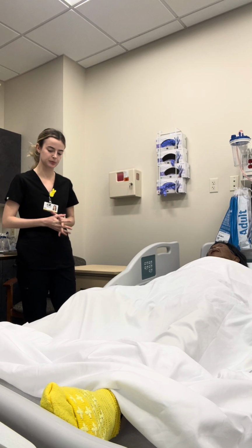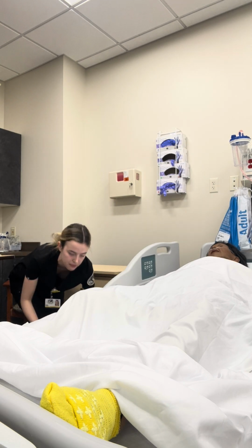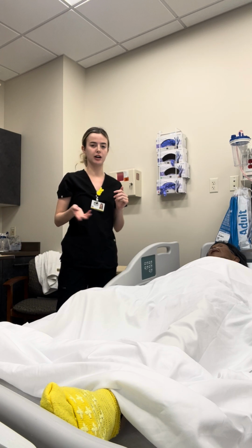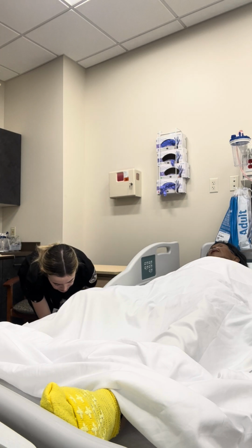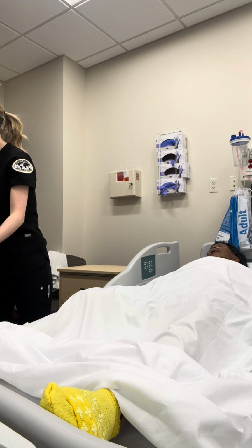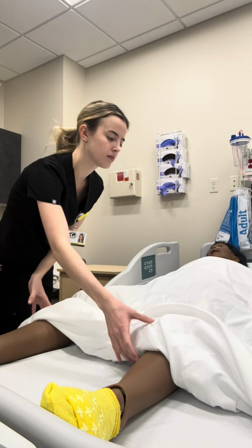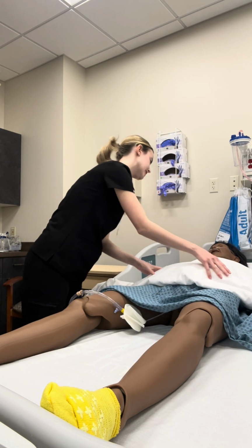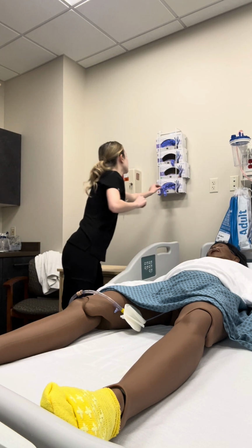So now that I have explained what I'm doing, I'm going to check the bag. I'm going to measure the output if necessary, empty the bag, note any characteristics that I would need to chart about the urine, and then I'm going to clamp the tubing. And then once that is clamped, you can go ahead and get ready. So we're going to roll this blanket back up again, just kind of like it was. I'm going to put on gloves.